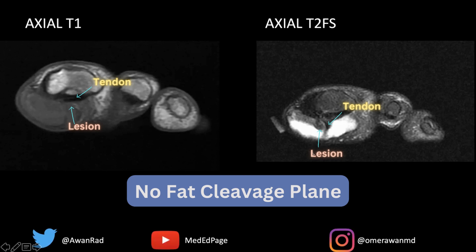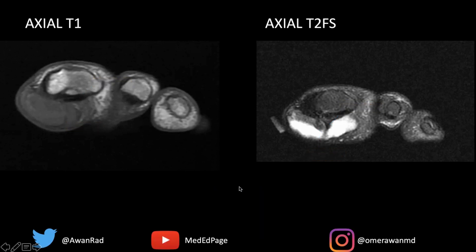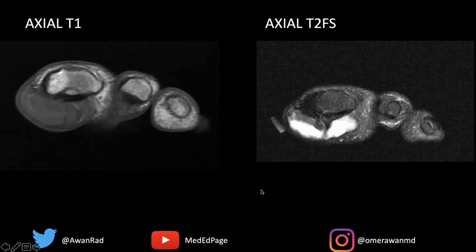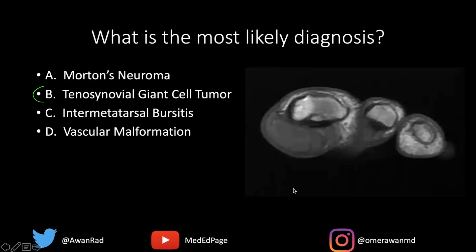That's a key component to this diagnosis, which makes tenosynovial giant cell tumor the correct diagnosis here, because of its intimate association with the flexor tendon.